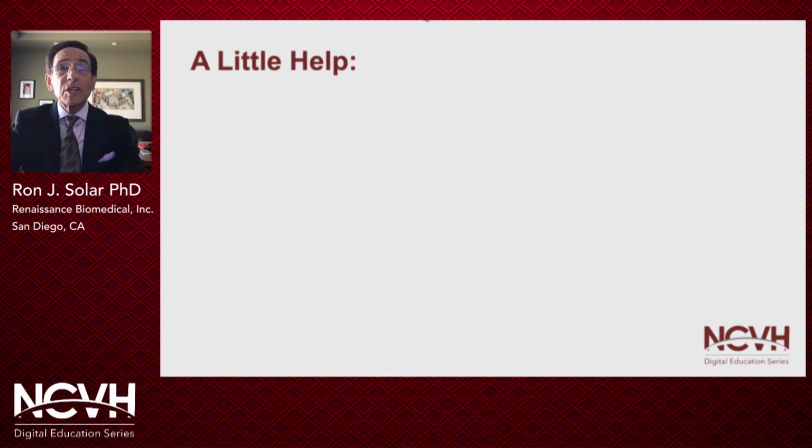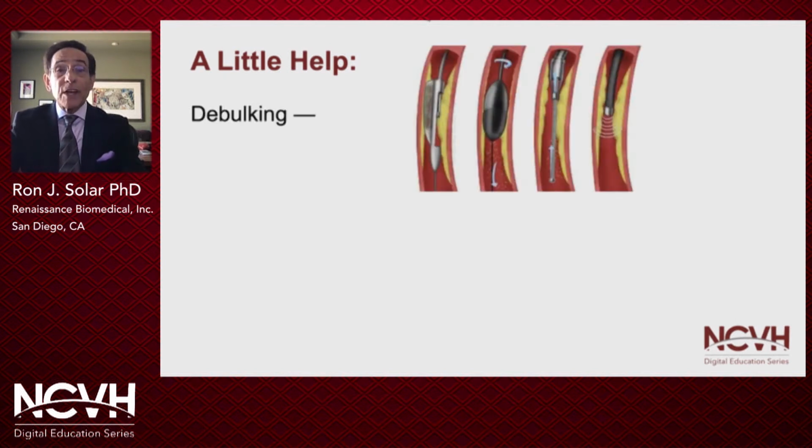So sometimes we need a little bit of help. You need some help so that you can break through this plaque. And one way you can do this, of course, is by debulking. And you can debulk with a number of techniques. You can choose to cut, grind, vaporize your way to reduce the plaque burden. And there are quite a few devices available. All have shown to work quite well.